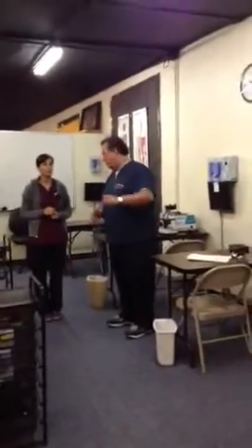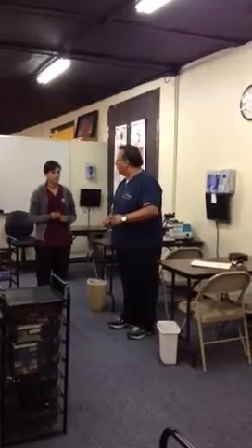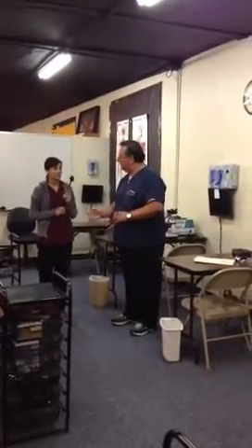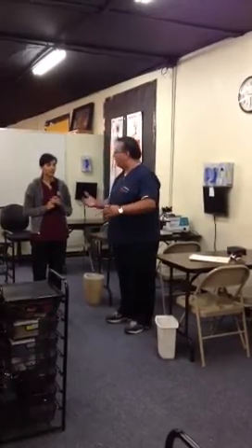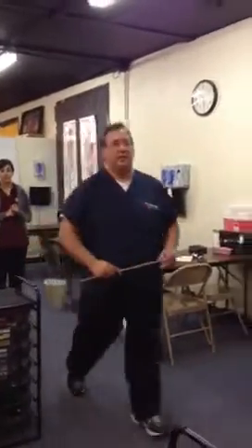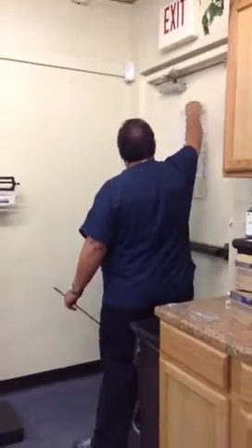I'm going to go over to the door and open up the chart that's hanging there. It's placed backwards so you can't see the letters, but I'm going to turn it around. Before I do that, I'm going to have you cover your left eye, and we're going to test your right eye first. During this test, don't step forward, don't lean forward, and don't squint to see the letters. I just want you to read what you can with normal vision, not straining your eyes. Any questions?